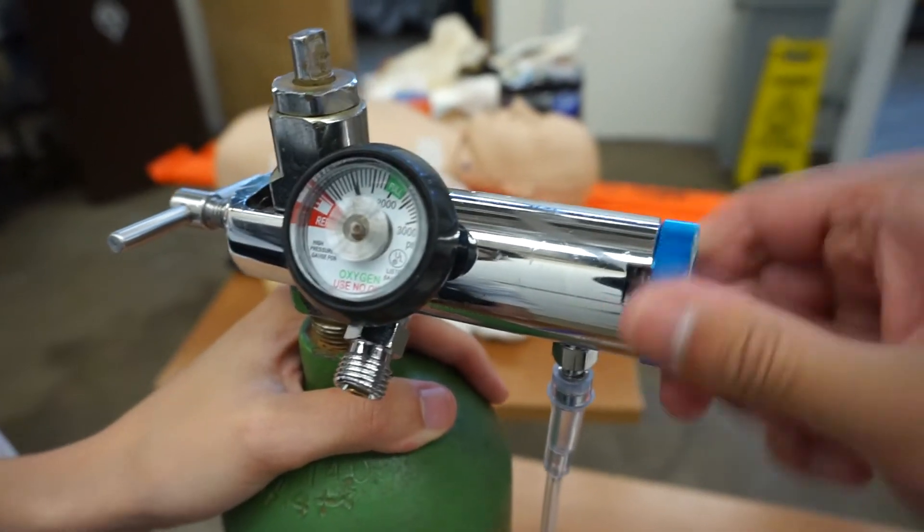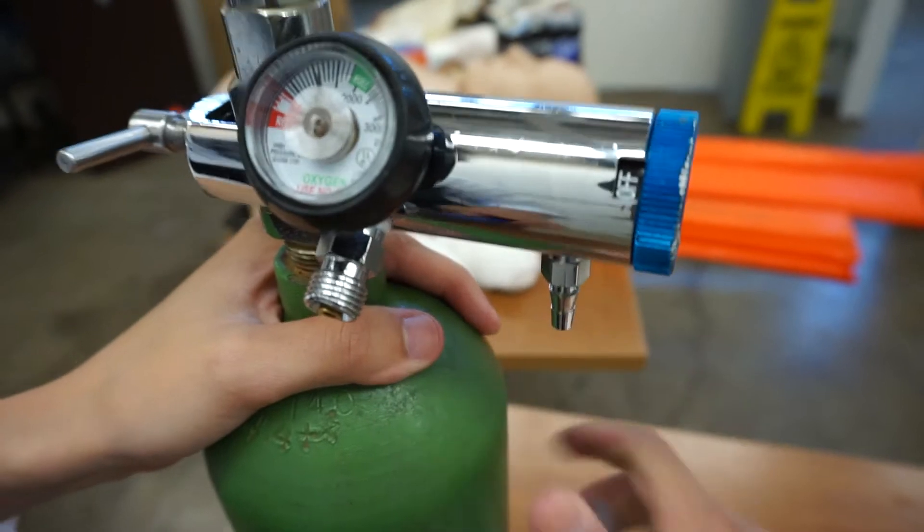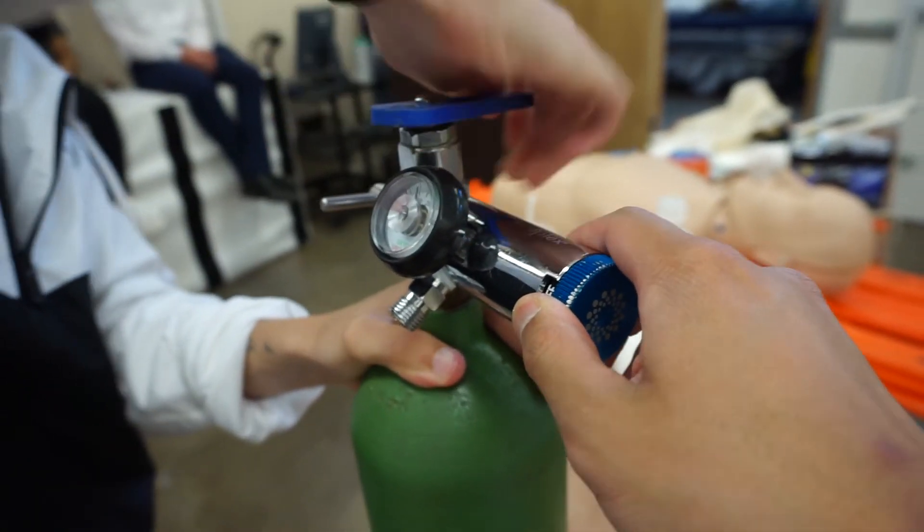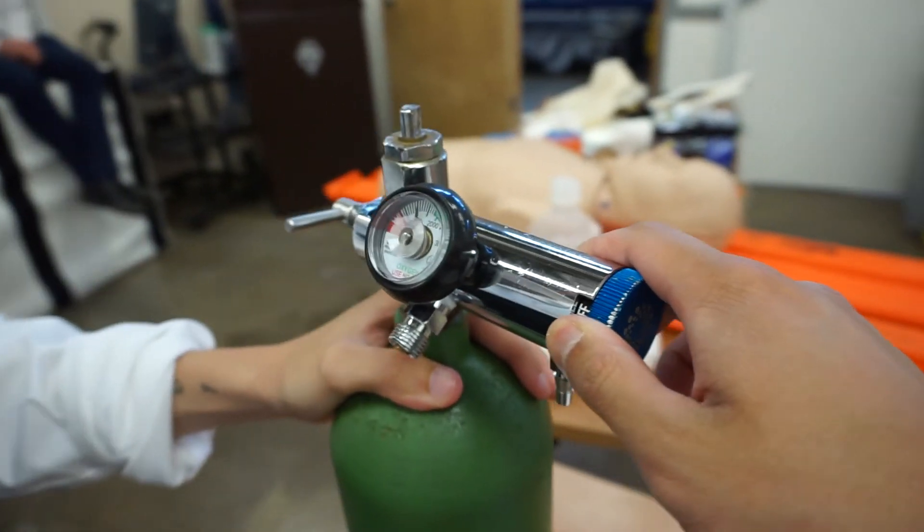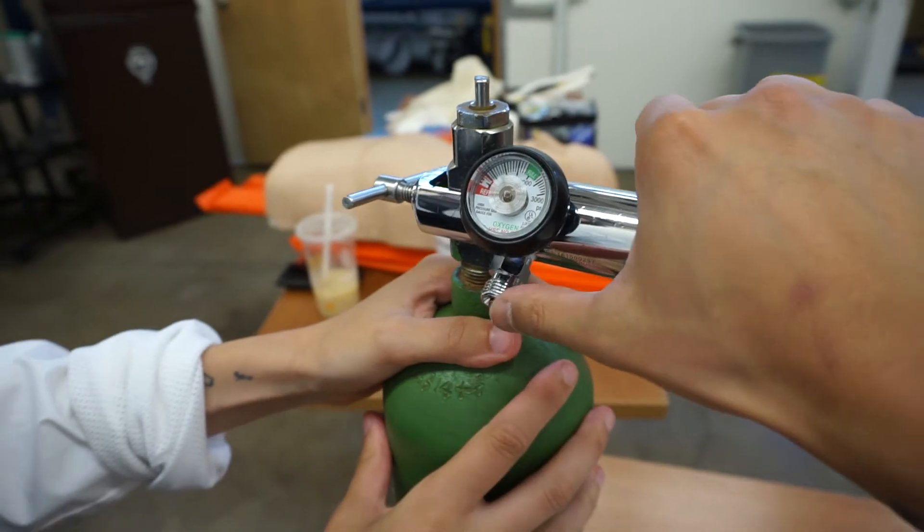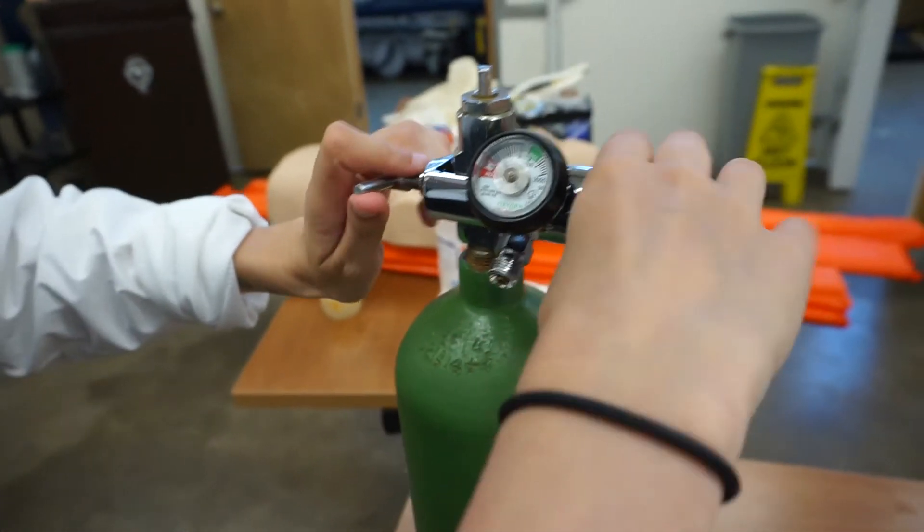Alright. And after you're done, you want to close the flow, and then you're going to lock the tank, so righty tighty. And then if you want, you can depressurize the tank by applying your finger into that quick connect spot, and then go ahead and undo the regulator.